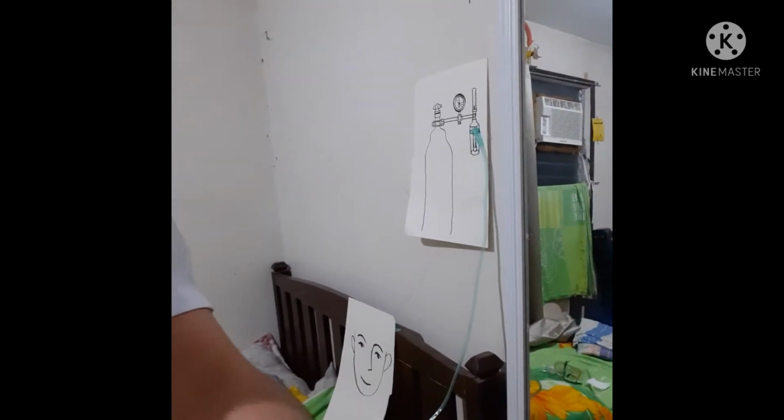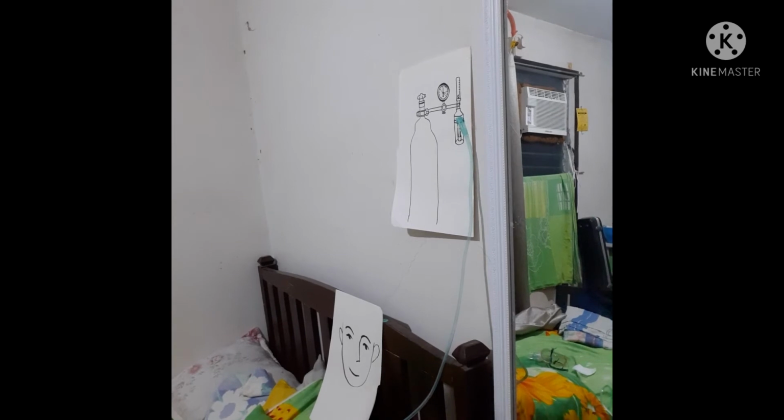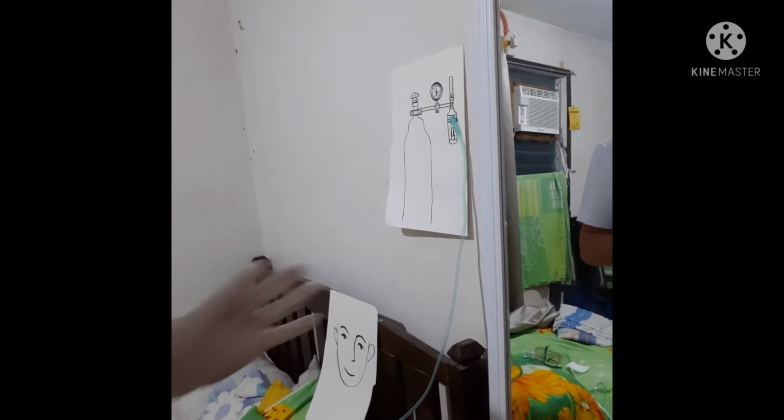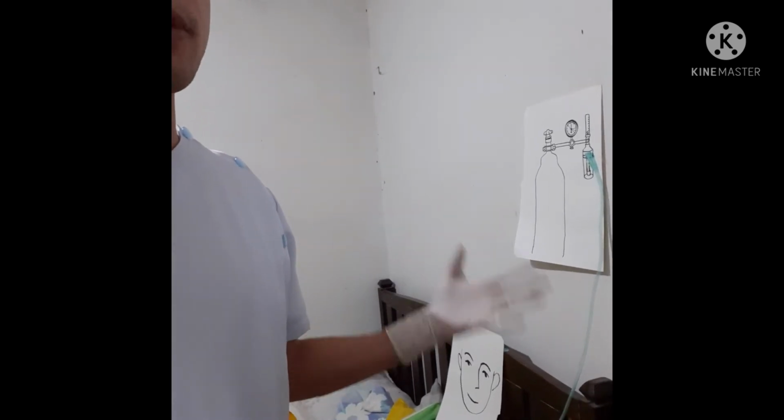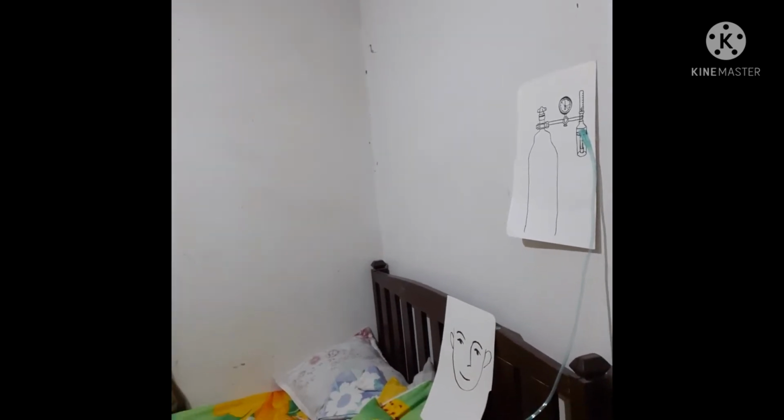Okay, so the next step that we are going to do is to administer, or to connect, the nasal cannula to the oxygen tank. Remember that we need to secure the place to make sure that safety precautions are met, and because the oxygen tank is a fire risk, it may cause fire sparks, so you need to put no smoking signs in the room.